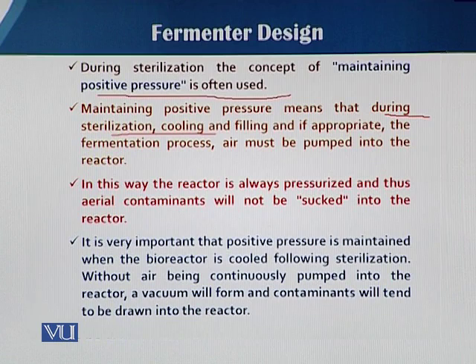So in all these cases, when there is a positive pressure inside, we cannot just switch off the oxygen delivery system. We have to keep it on, with a continuous supply of air just to make the positive pressure. Why? We will talk about it in a later slide.